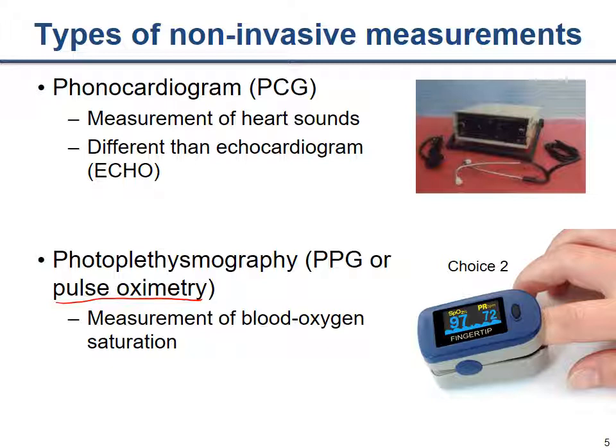So the measurement can be performed by shining a red LED through the finger, where a good artery that is not too far below the skin is located, and measuring what we call the path loss at the other side of the finger using a photodetector. Now, there are complications in doing this with precision and accuracy: changing light conditions, absorption by skin, bone, etc., absolute and relative concentrations. But they can be solved through a variety of means, knowing that the heart beats at regular intervals and so on. Ultimately, this technique involves optical sensing, where you shine that LED through the finger and measure the characteristics of the blood in that way.